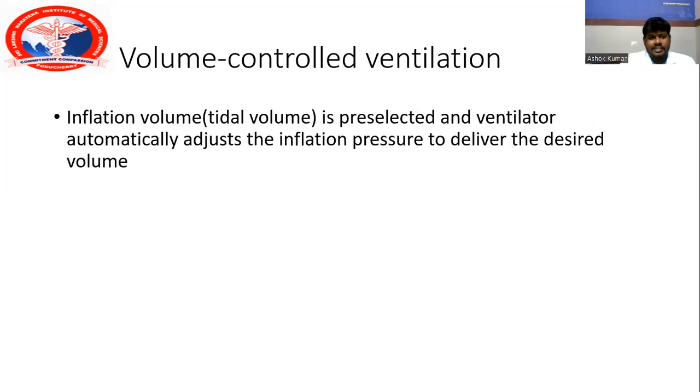First, volume control ventilation. Define volume control ventilation. Okay, volume control ventilation is nothing but inflation volume, that is tidal volume.